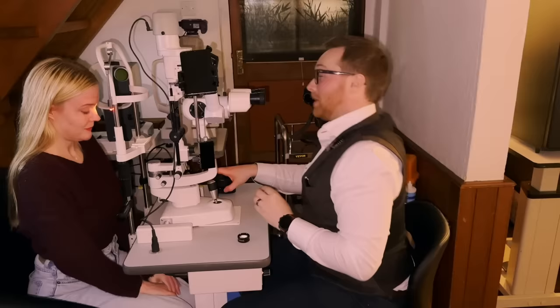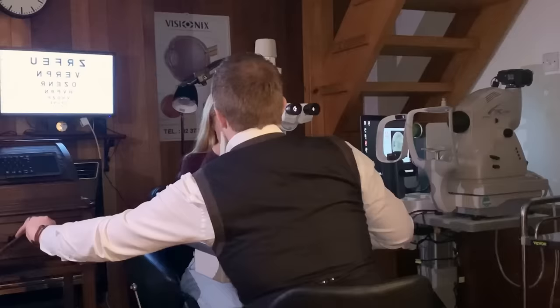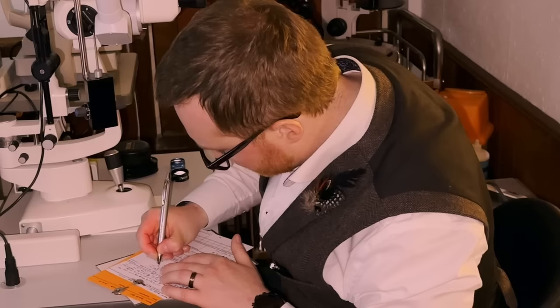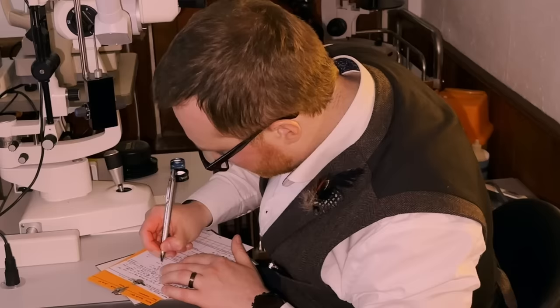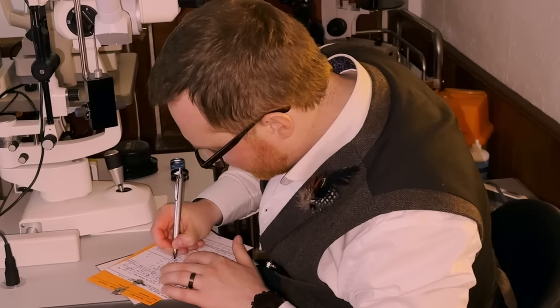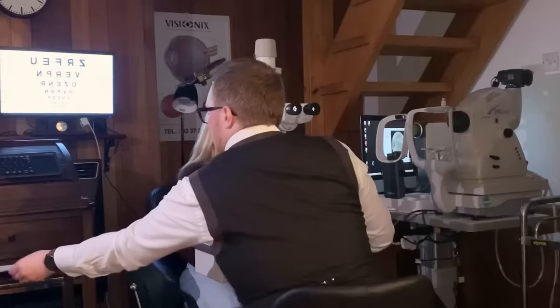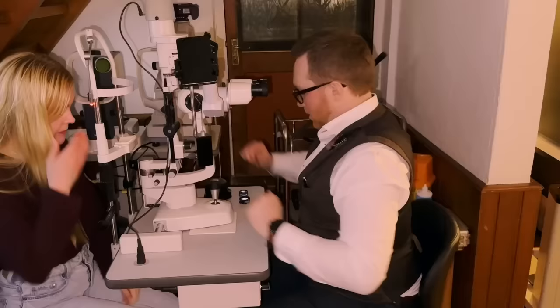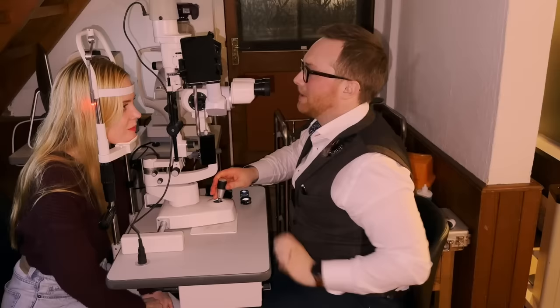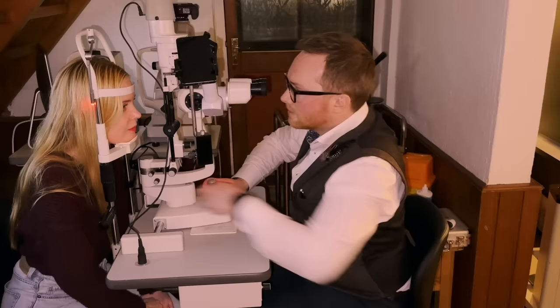You're welcome to have a break for a second if you just wanted to let your eyes recover from that, because it's quite a bright light. Yeah. And then we'll do exactly the same for your other eye. So, tuck back on the chin rest there for me. And this time I'm going to get you to have a look past my other ear. It's a bit tricky with that extra eyepiece in the way, but vaguely in that direction is fine. Okay, let's just turn back on. Brightness down a bit.